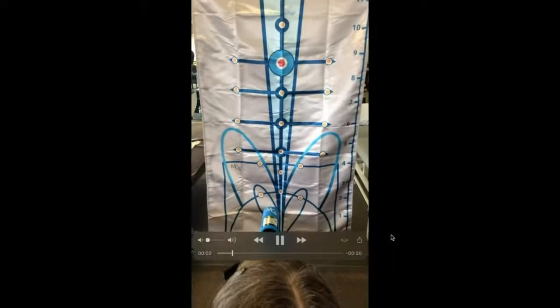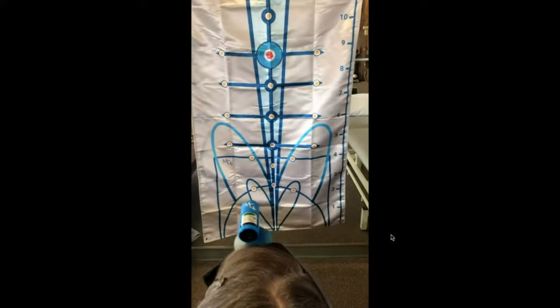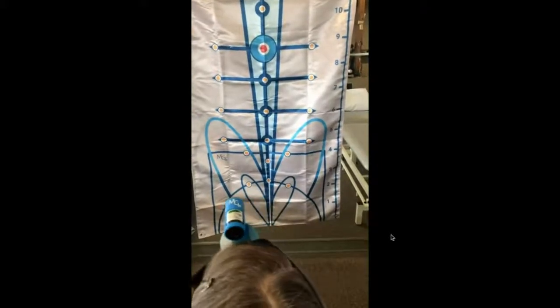So she's going to have the laser up. There we go, but she's looking down, and now the goal is just to get smooth movement of the laser, equidistant between the two orange targets.